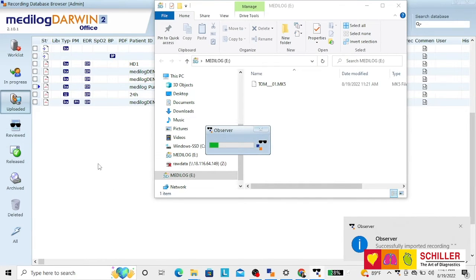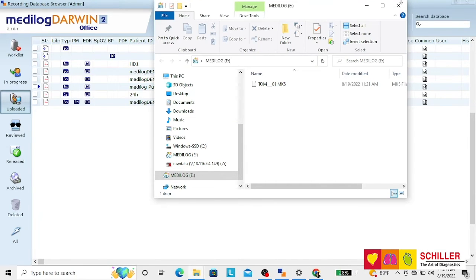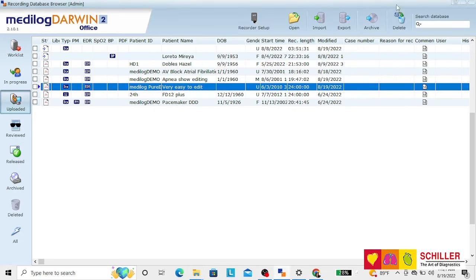We will wait until the Observer finishes. When the full line is in green, we can close Observer and this.